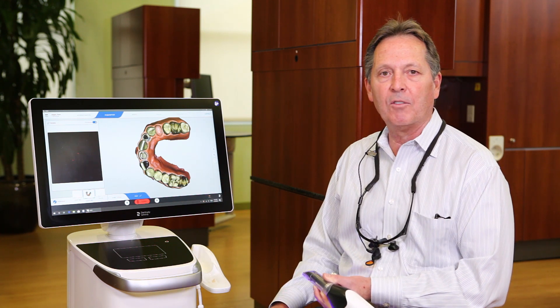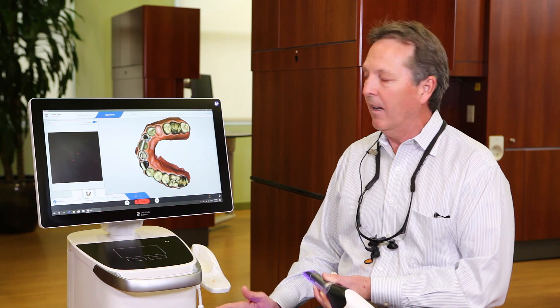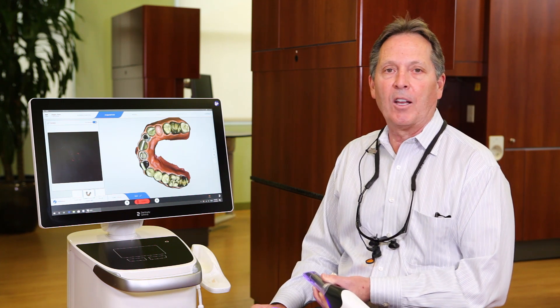It's fantastic. It really lends itself to a single person scanning without much of an incident. Super easy to use — I think you're going to like it a lot.